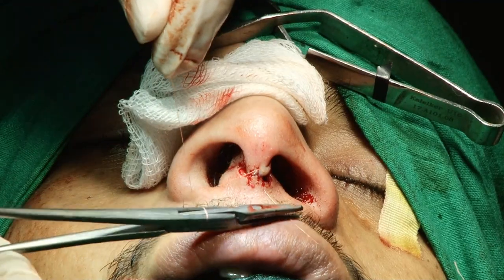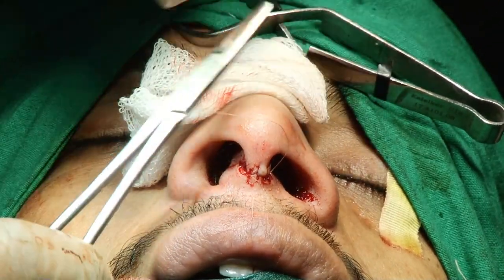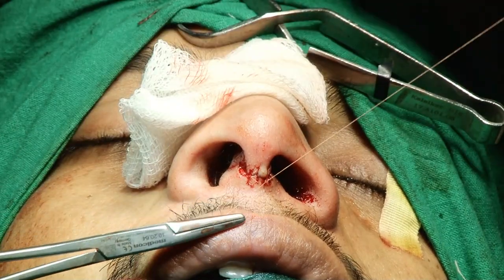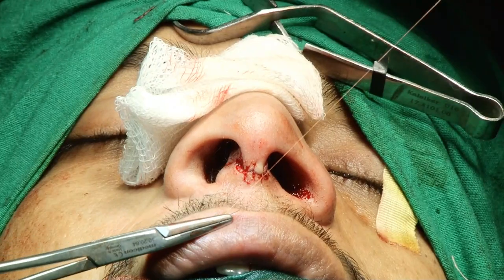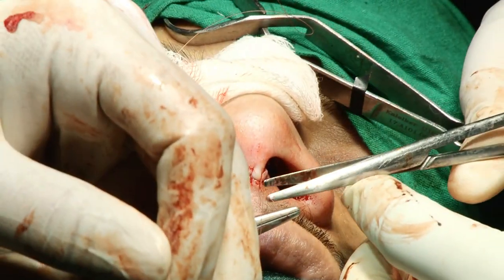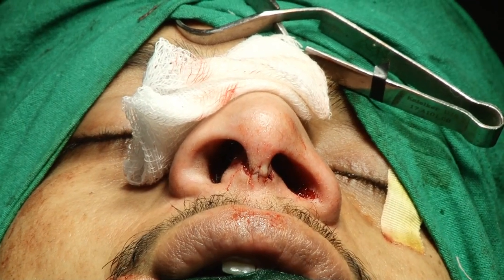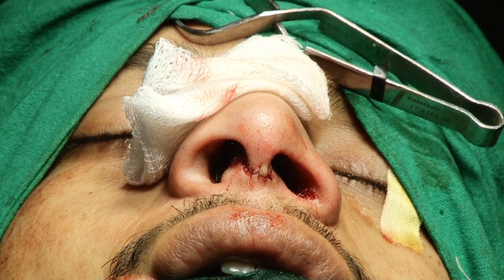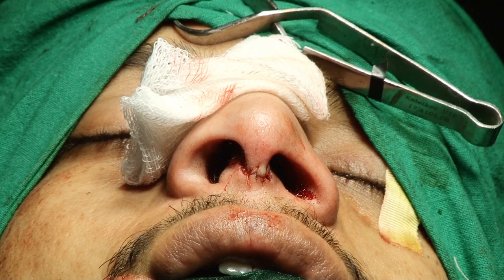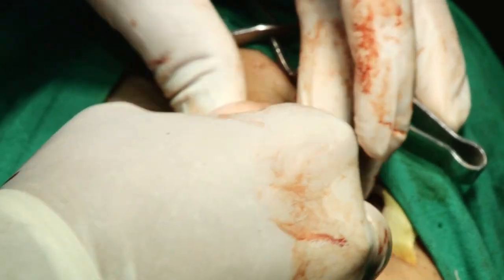Third suture. Now, when did you change to using Vicryl Rapid, since you had always been using permanent sutures before? Yes, sir. What do you say? I said that you used to use permanent sutures before. Did you change to Vicryl Rapid now? Yeah, Vicryl Rapid. Not permanent, sir. I use the same that we use in our course.